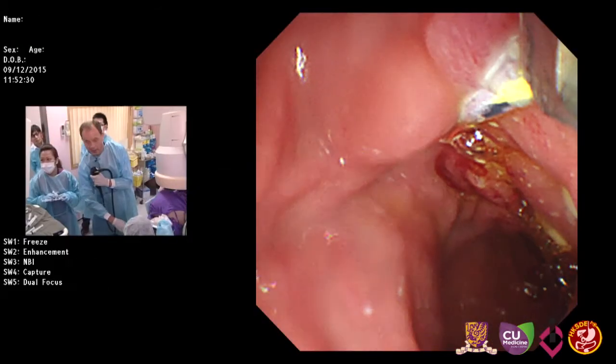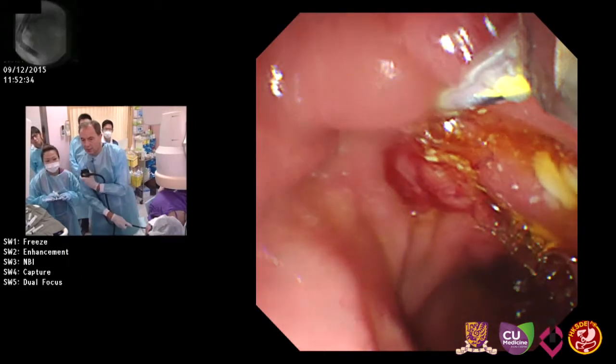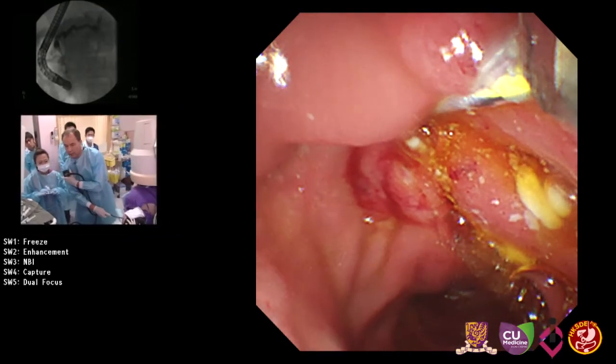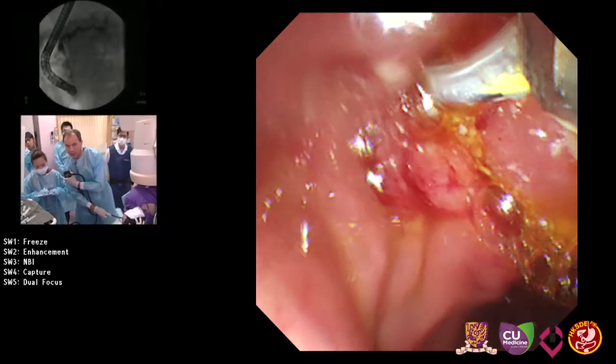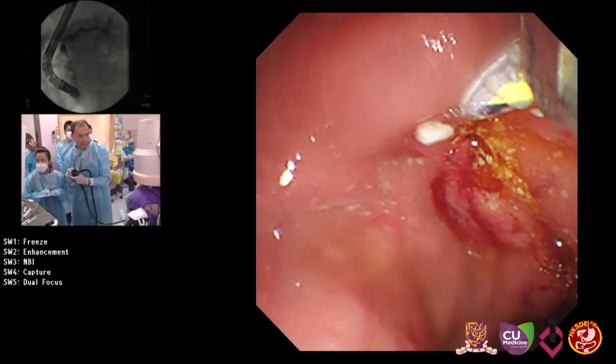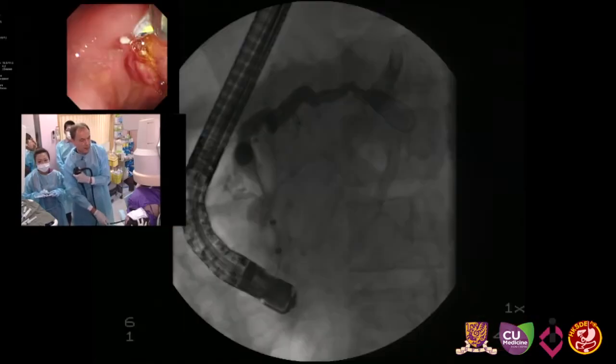Okay. So Horst, we would like to show you more or less the final stage. When you have the duodenoscopic image, you see all the fragments we could remove. Yes. And do you have also now the fluoroscopic image, the X-ray? Can we have the fluoroscopy image?